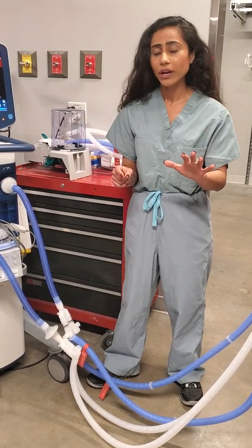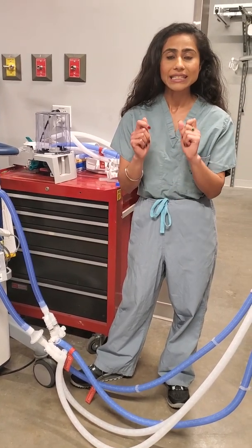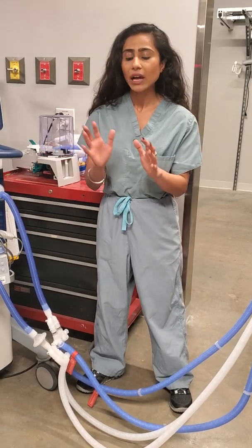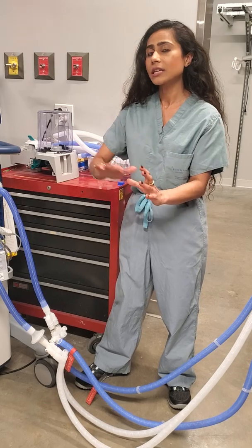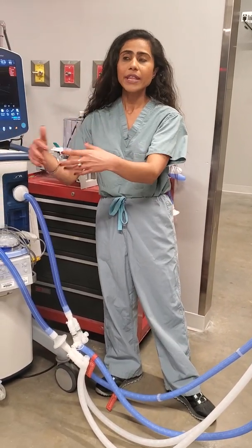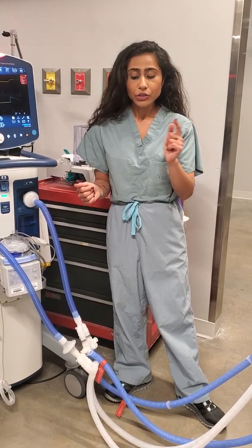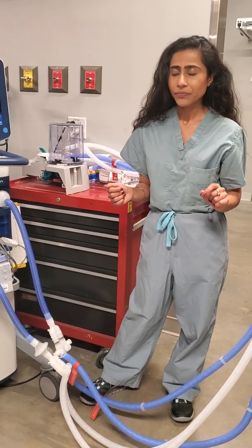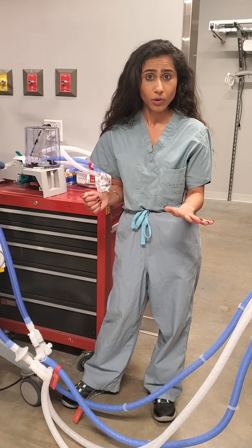That brings us to the next point: you may want to group patients with similar disease severity onto one single ventilator. If you have three to four patients with severe ARDS, group them together on one ventilator, and have another ventilator for the next set with moderate ARDS. Do you have to group them by body weight? Perhaps not, unless you're planning to use volume control mode.